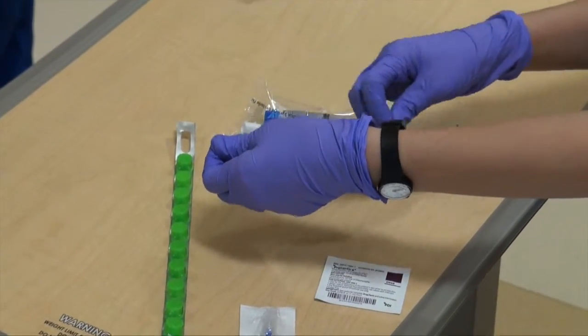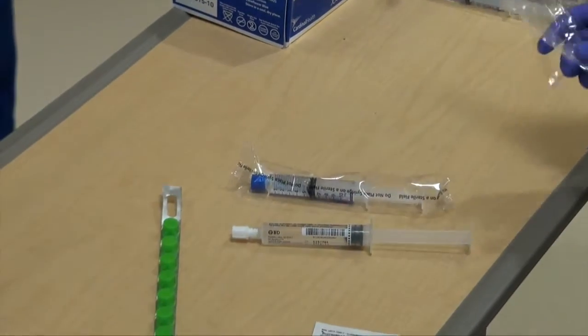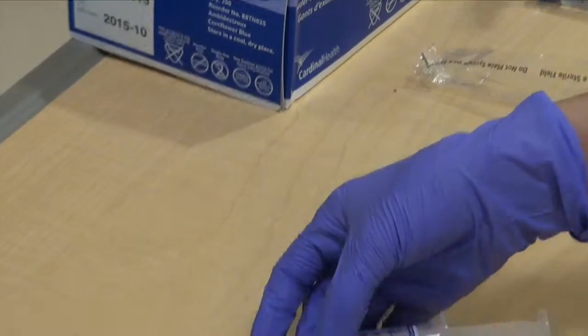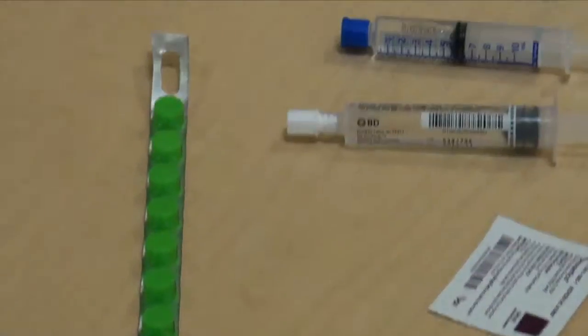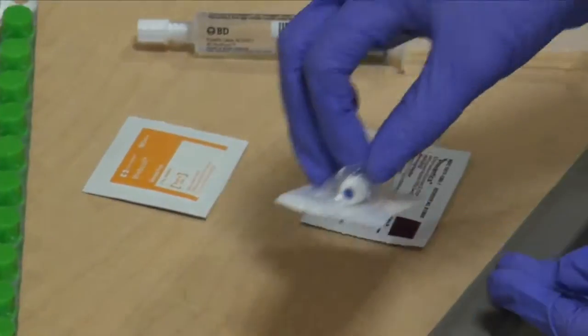Sodium chloride flush, heparin flush, CHG wipes, alcohol wipe, a new cap, and Curos caps.